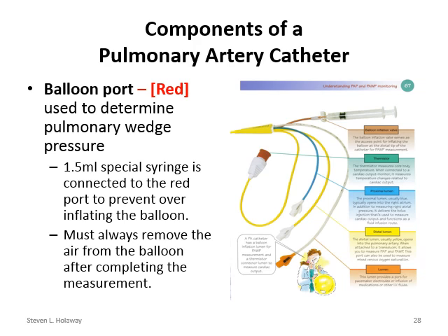The other thing that can happen is if you're having trouble inflating, the catheter may have moved further downstream and you're in a small capillary, and you can actually cause more problems by doing that. You can actually rupture a capillary bed or pulmonary capillary if you do that. So be very careful when you're doing these. You should only leave it up around 15 seconds to get your measurements, and once you do that, take your syringe down. Again, to be on the safe side, once you're finished, take the syringe loose to discard any air that's in the syringe, connect it back up, and make sure that your slide lock or your three-way stopcock is turned off.